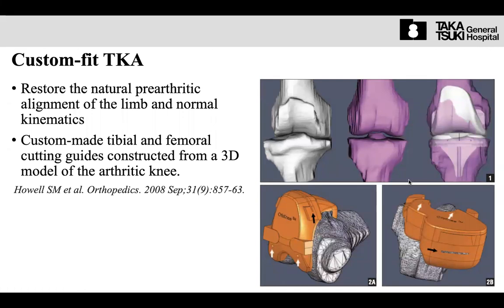Okay, let's start. So yesterday I told about the custom fit TKA. This is a very, very new concept. It is completely different from mechanical alignment TKA. The purpose of this TKA is just to restore the patient's native or pre-disease articular surface, using the PSI.